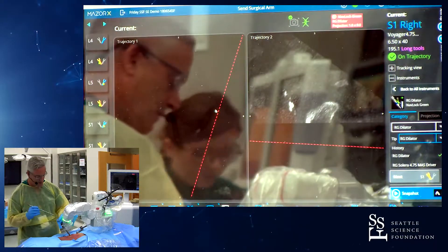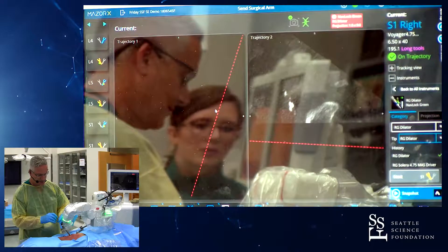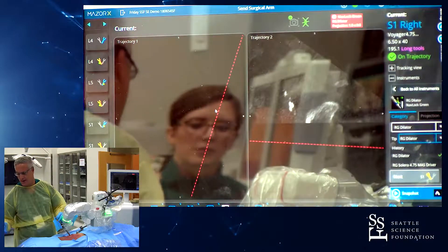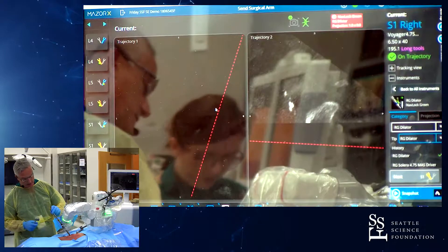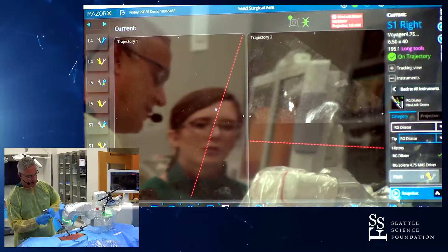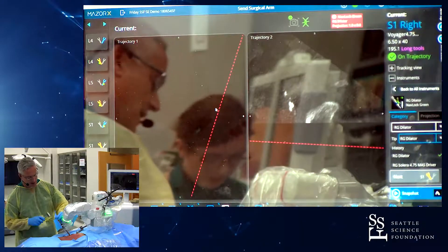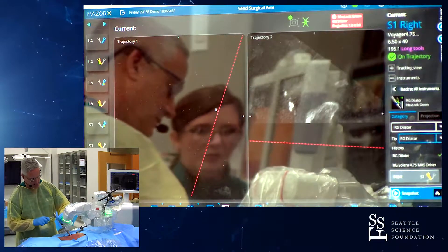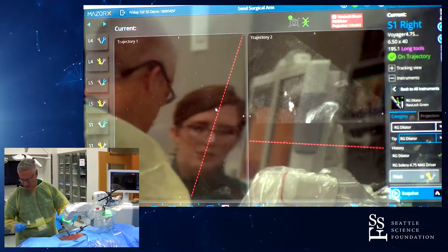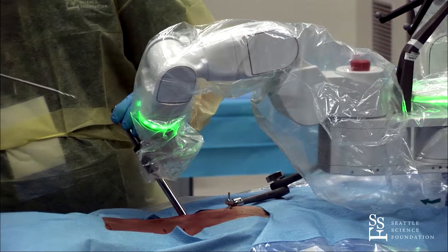One of the pitfalls associated with robotic spine surgery with any system is skive. What we have here is an anti-skive mechanism that's serrated on the end. You place it at your docking point and then mallet it into position so that you don't have any motion of the end of the cannula.